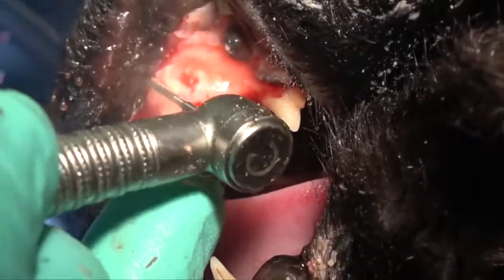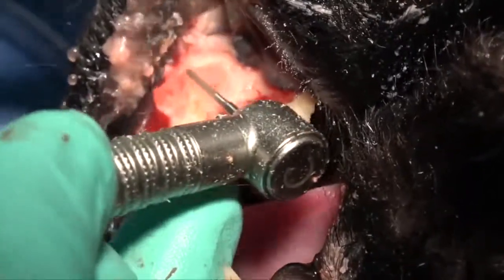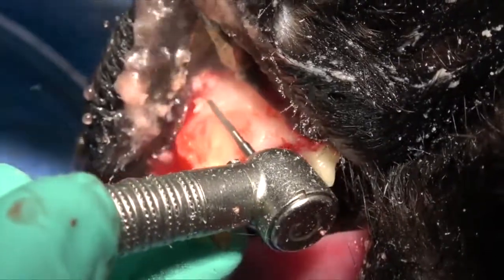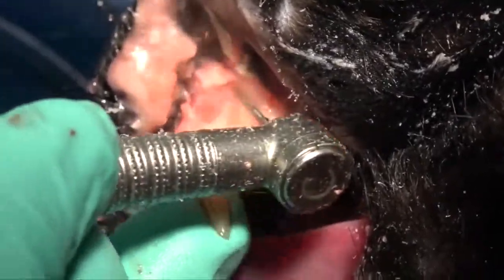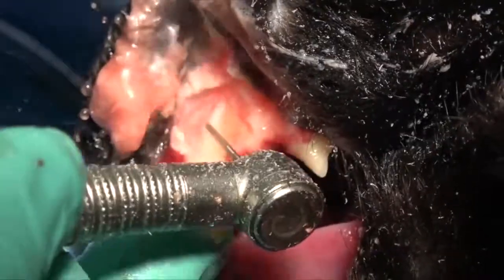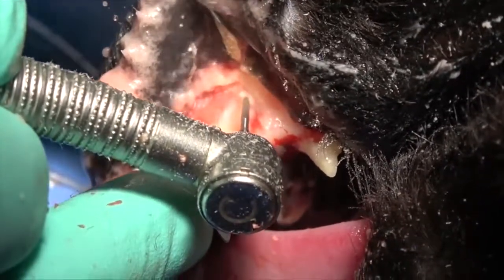We'll use bone removal with a 701L burr. That vestibular bone is really friable, so the burr has a tendency to just kind of drop down in there. It's very porous bone — not like the normal bone that covers the canine tooth — so you have to be very gentle so that you don't dig down into the tooth too much. It doesn't matter if you dig in some; you just don't want to go really deep.